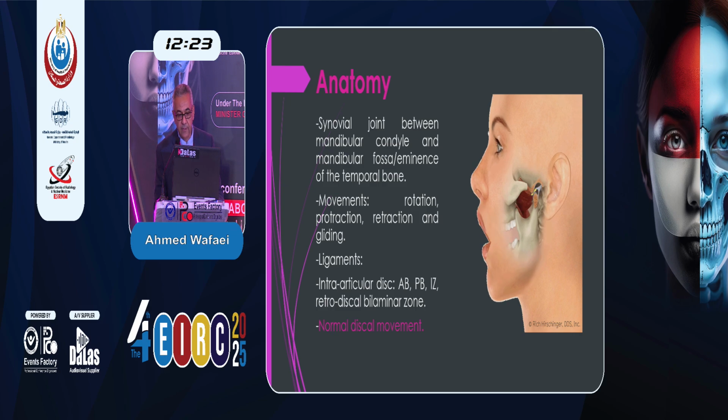There are two important factors in imaging. Number one is the posterior band of the intra-articular disc should lie at the summit of the mandibular head in closed mouth, and then the disc glides anteriorly in open mouth, with the narrow intermediate zone always between the mandibular head and temporal bone in the narrowest portion of the joint. Thus, the intermediate zone constitutes the point of rotation in the joint between open and closed mouth.